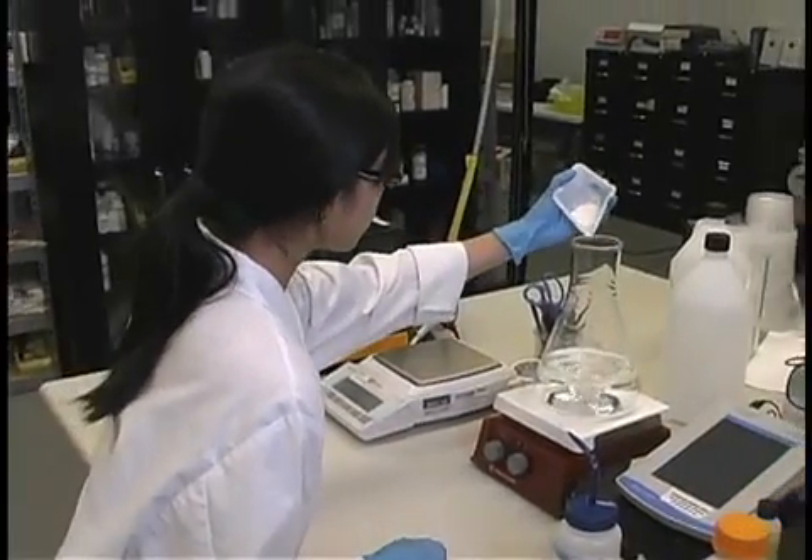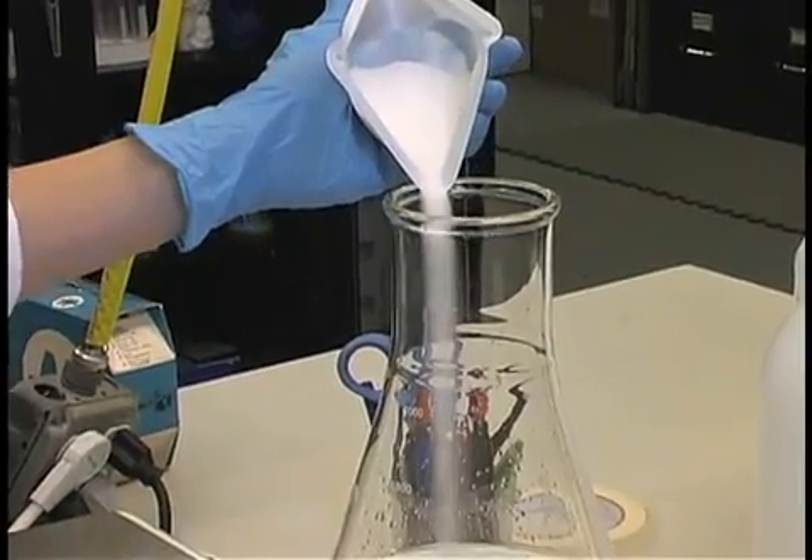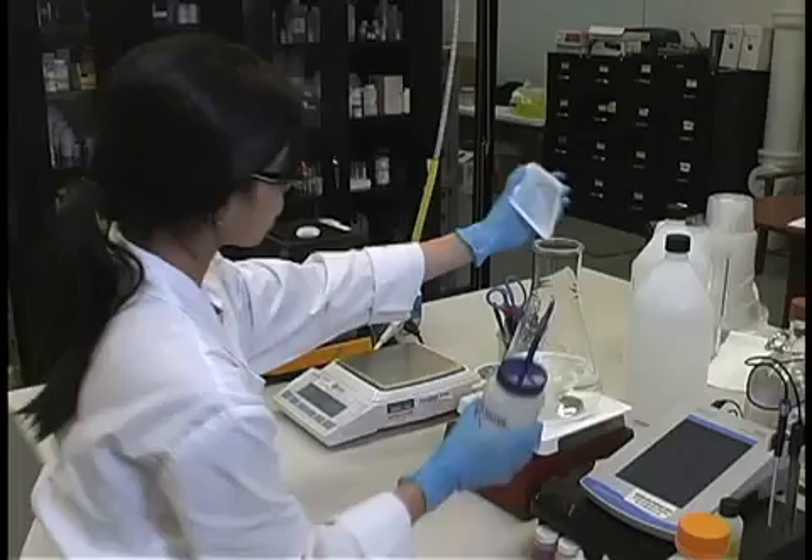Slowly begin adding the dry components to the medium being made. Stir each component of the medium until dissolved.